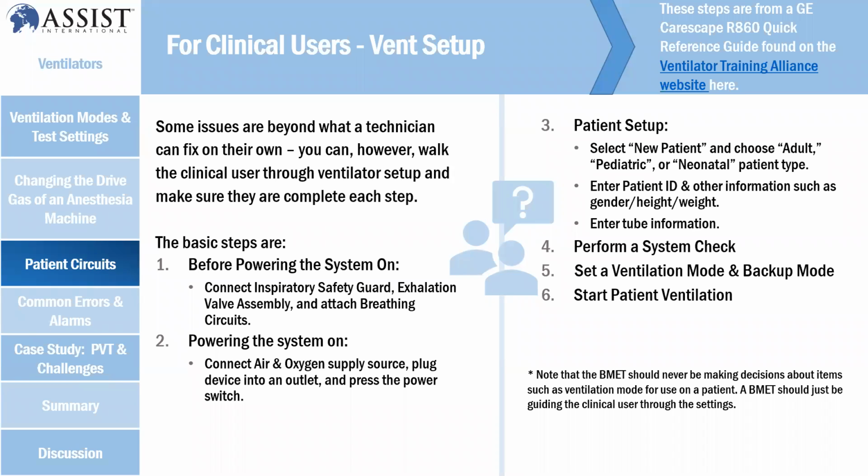This is very important for the clinical user. From my experience, we get complaints from clinical users telling us the machine is not working properly. But what happened is they don't do verification earlier to see whether the self-test passes or not. So eventually patients struggle to breathe. So it's very important to do early morning verification and before using it on the patient.